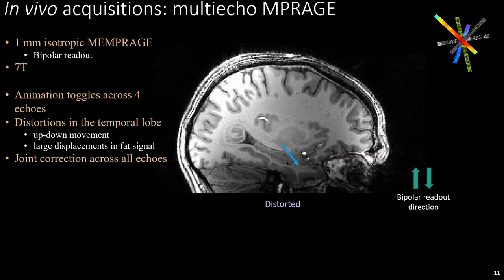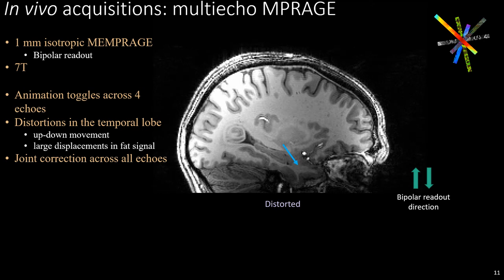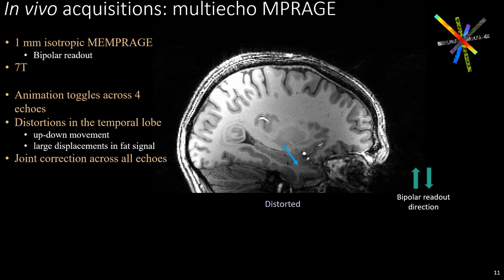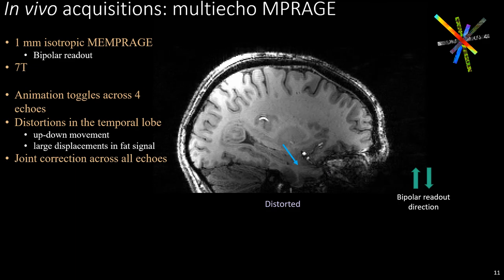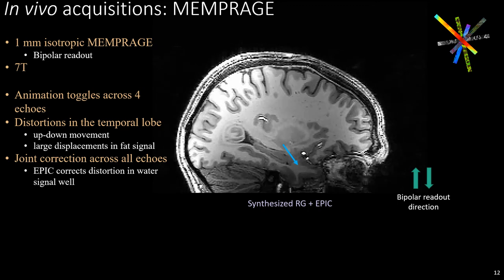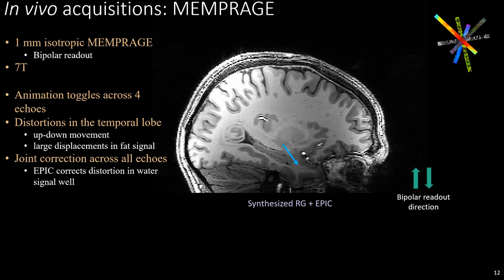We show a 1 mm resolution multi-echo MPRAGE dataset. The animation toggles across all four echoes, and we can observe movement in the temporal lobe due to distortions. EPIC stabilizes the temporal lobe, corrects the distortion, and aligns all the echoes, eliminating the up and down movement. This can improve the relaxation parameter estimation from these echoes.